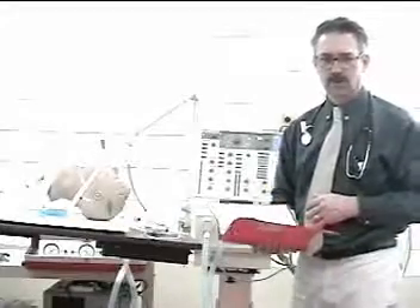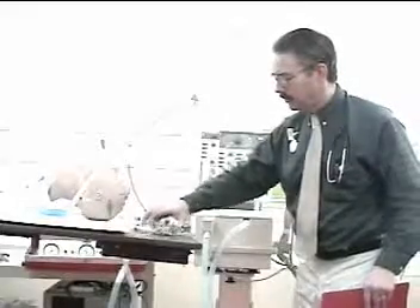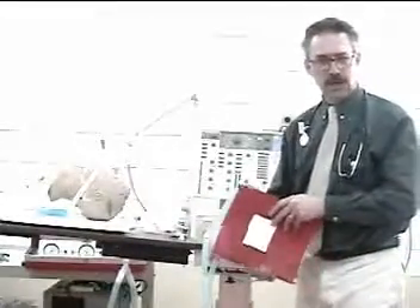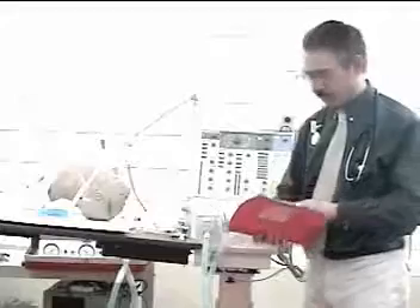Next, gather your equipment: a stethoscope, a pulse oximeter, a cuff manometer gauge to measure cuff pressures, and any other equipment specific to the measurements that must be taken during ventilator monitoring.